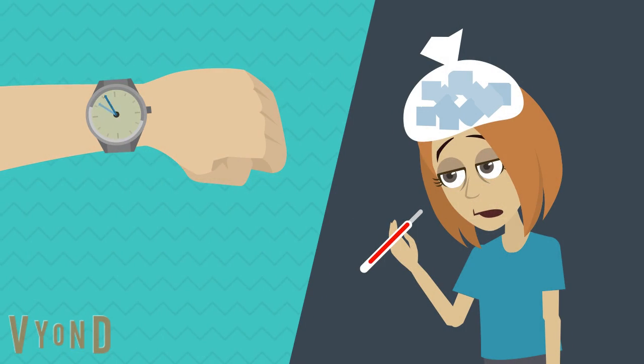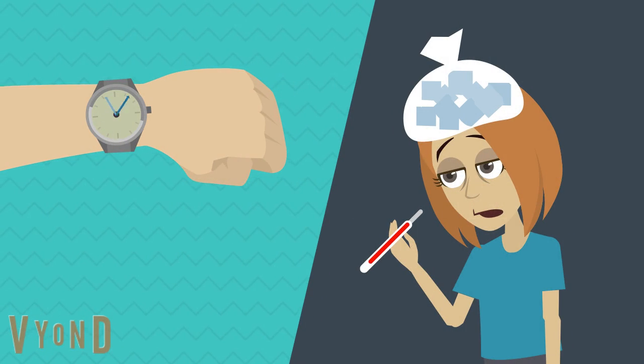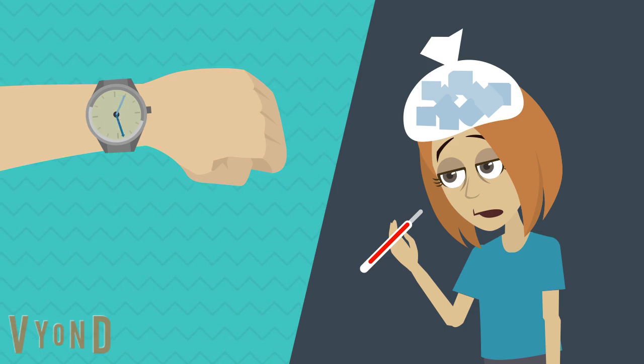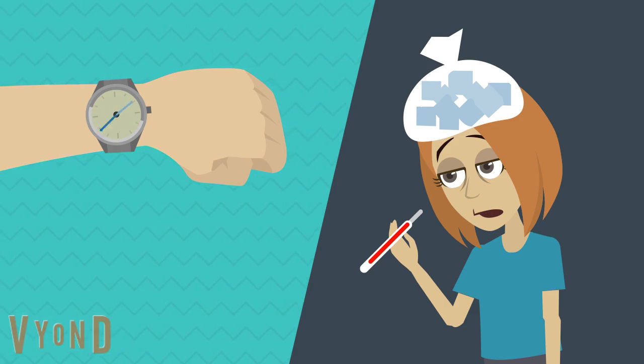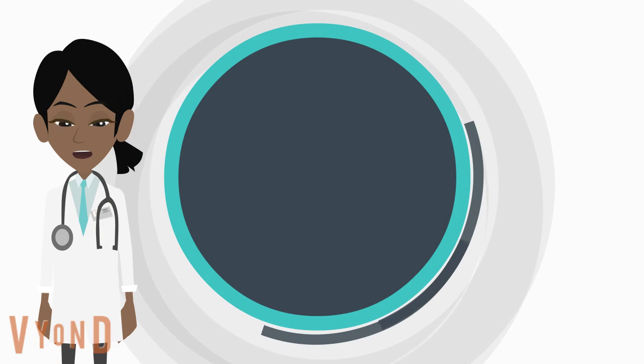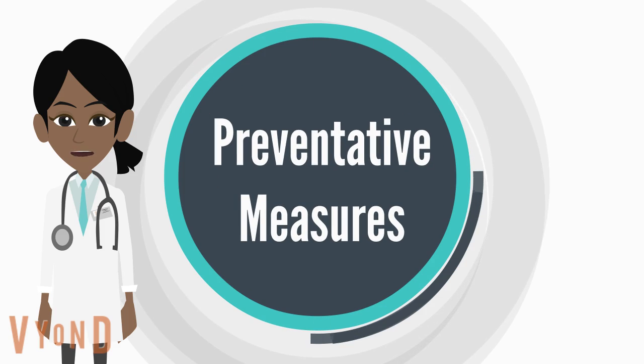In all of these, the patient's prognosis depends on how quickly the negative reaction is identified. The possibility of death due to these complications is very real. For this reason, strict guidelines for all stages of the cross-matching procedure are in place as preventative measures.